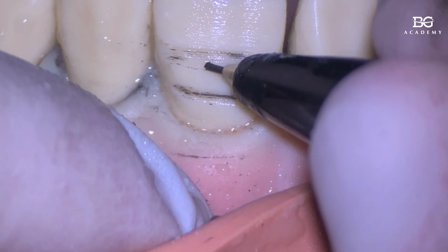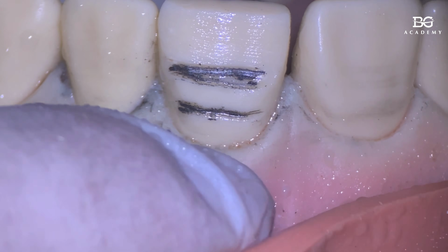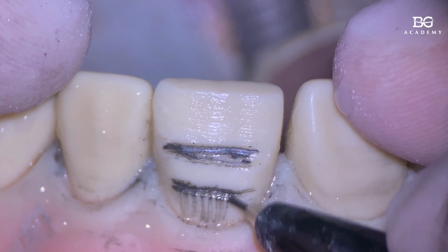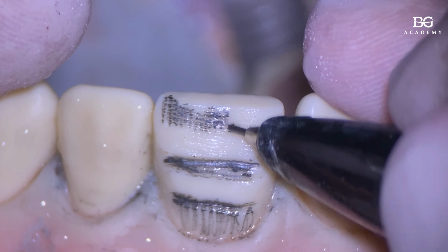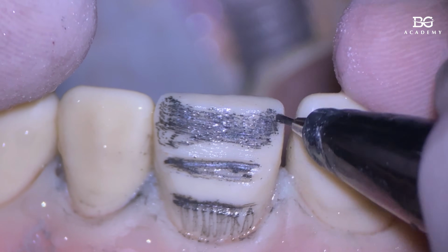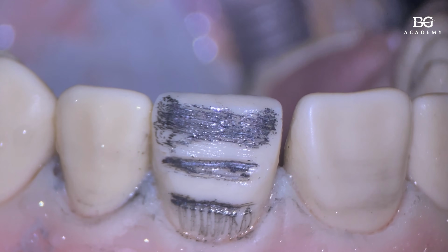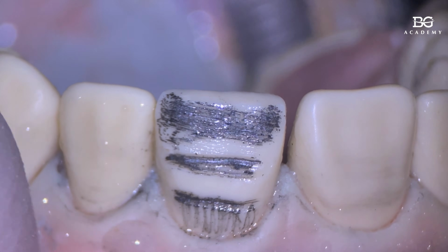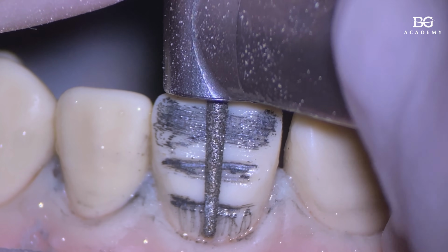Let me remark the grooves that we get from our depth cutter. So now I don't want to prep here, and I don't want to prep here. I want to prep here. That's the middle plane. So my bur will be placed parallel to the middle plane. There is a bulbosity there, by the way, so actually parallel to the bulbosity, convexity if you want. It's like that.